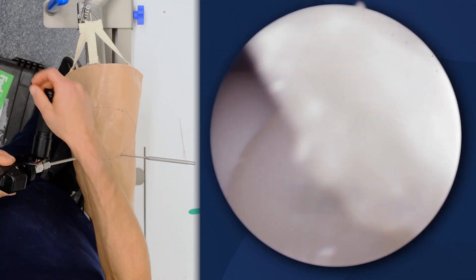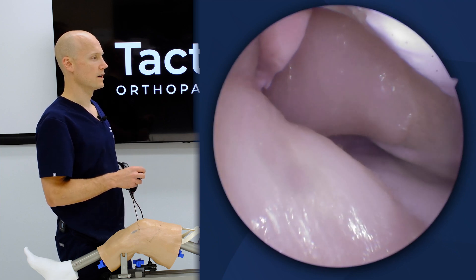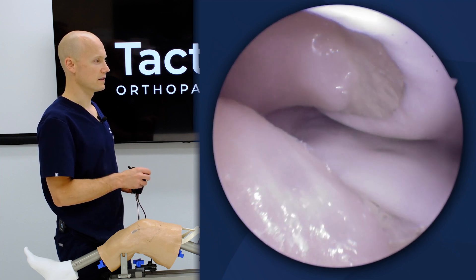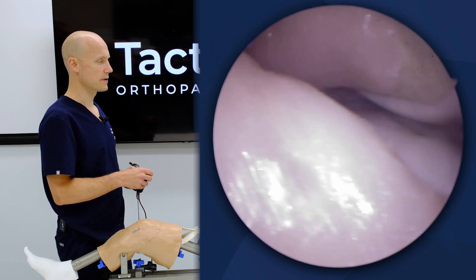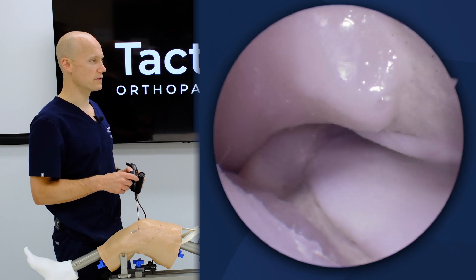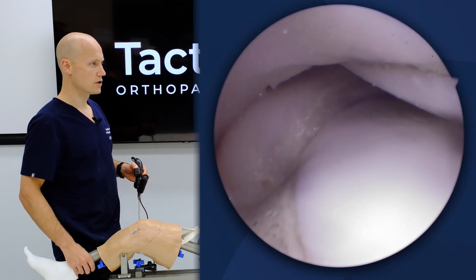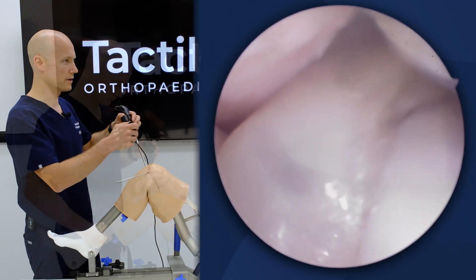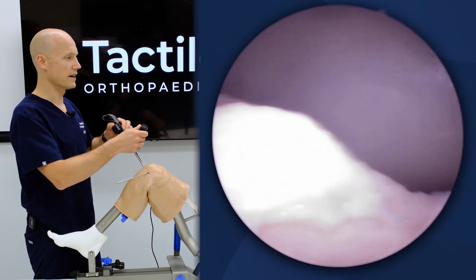That is the basis of the anatomic pertinent structures in the anterior aspect of the knee. I'm going to now travel and show you some of the benefits of teaching posterior access. We can do a sub-PCL — I'm going to go ahead and travel. You can see the septum; I'm going to go in and pop through.